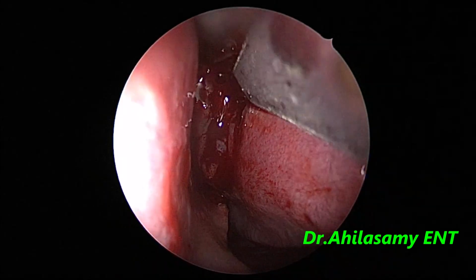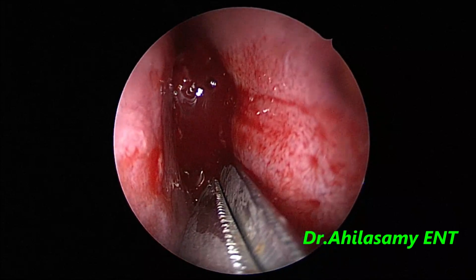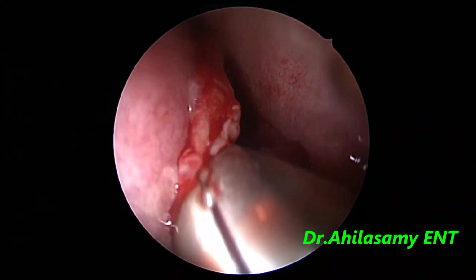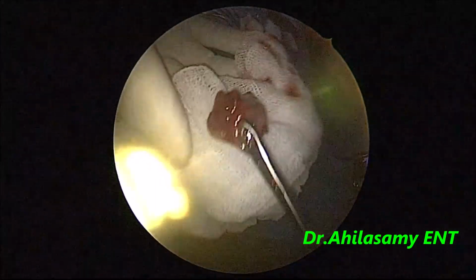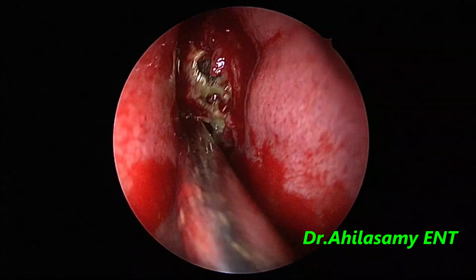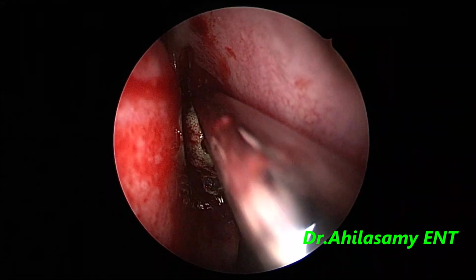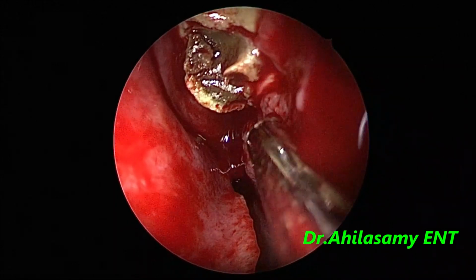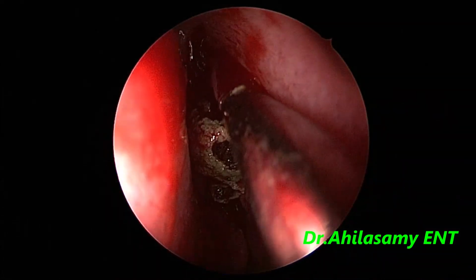Now I am using the scissors to cut the dissected uncinate process superior end and the lower part, and I will remove the uncinate in toto with the Blakesley forceps. Now once this uncinate is removed, you can see fungal material in the hiatus semilunaris, that is between the uncinate and the bulla. It's a maxillary fungus which has come into the hiatus semilunaris and into the middle meatus.